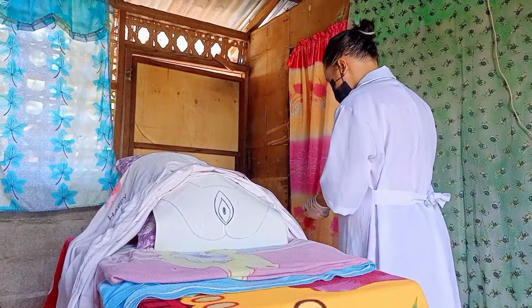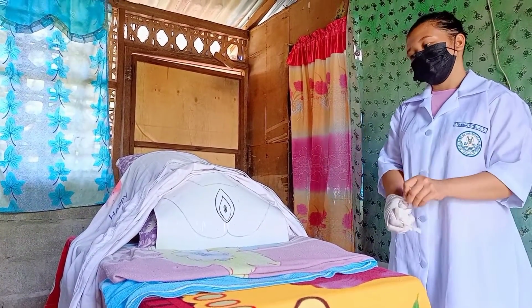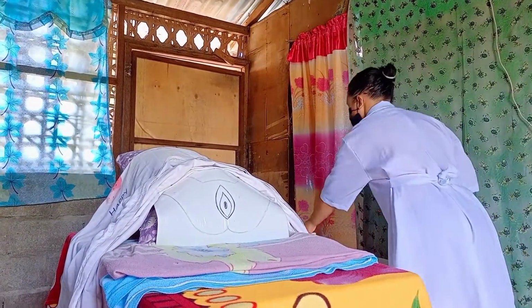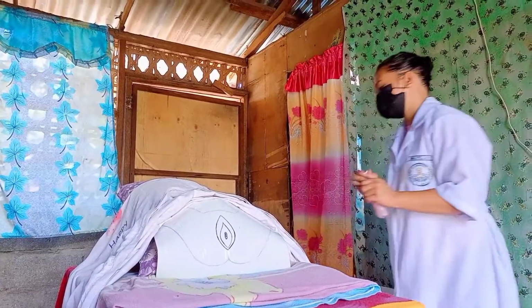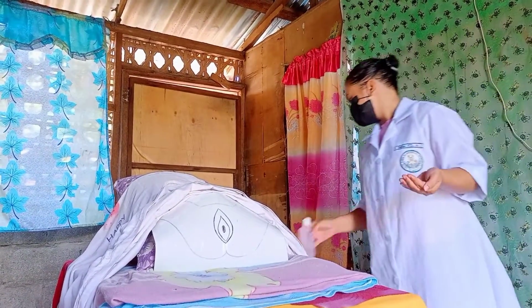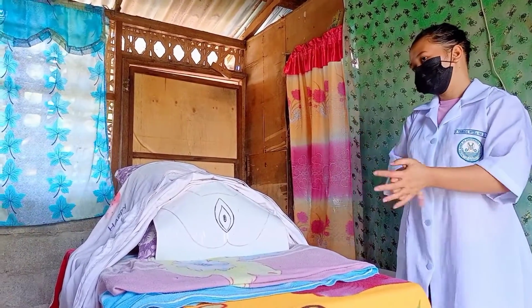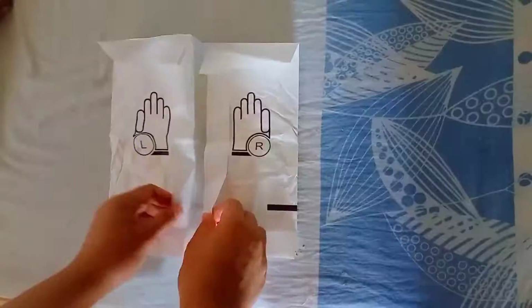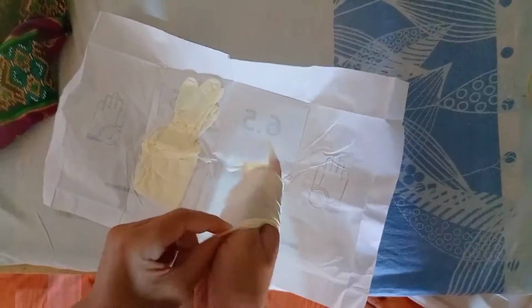Remove and discard gloves, wash your hands or sanitize your hands. This procedure is to prevent contamination. Also don sterile gloves to maintain aseptic technique.